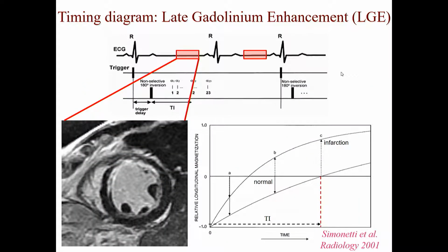This is the so-called late enhancement technique that I want to get into now. This is a method that is, again, T1 weighted. It is aiming to bring out the scars, as in this case, from 9 o'clock to 2 o'clock, you can see a layer of scar in the endocardium. This is a patient with a large myocardial infarction that is chronic. The outer part, the epicardial rim of the heart muscle, is normal, is not infarcted.